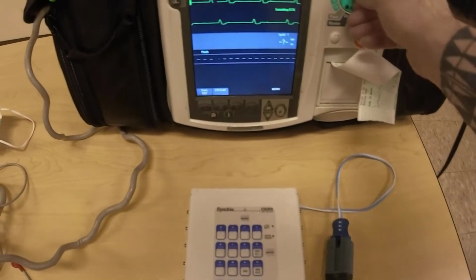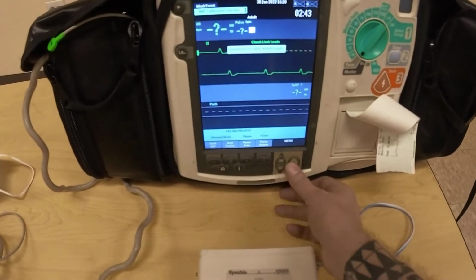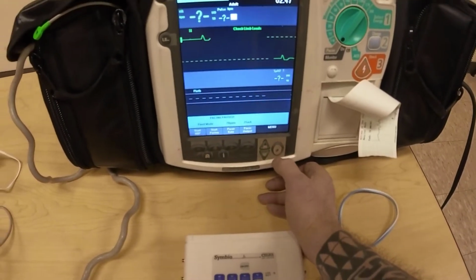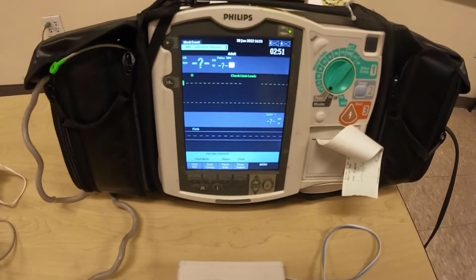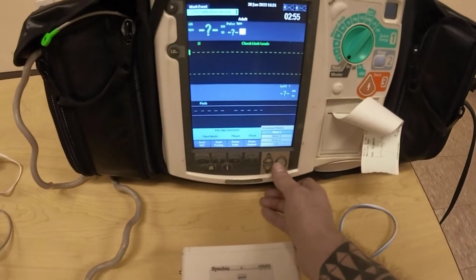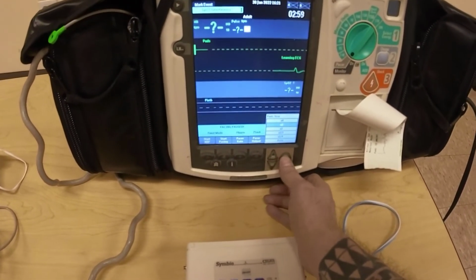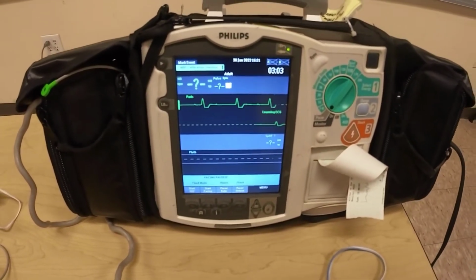And we're going to go to the pacer mode. It says connect ECG leads. But you know what I'm going to do? I'm going to say pacer mode, and I'm going to say fixed. And you see how it's showing me lead 2 and there's no EKG. I can, however, say displayed waves, lead 1. We're going to go back to pads. Make this ×1. So pads are displayed. We see a third-degree heart block.